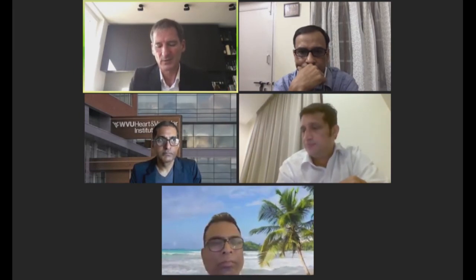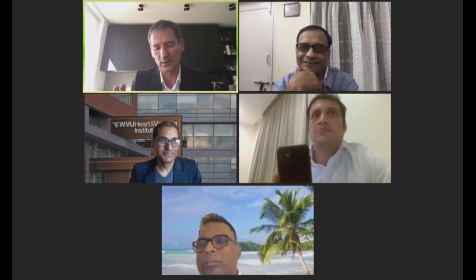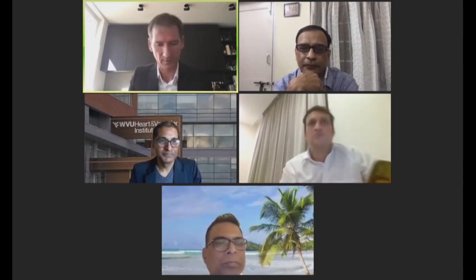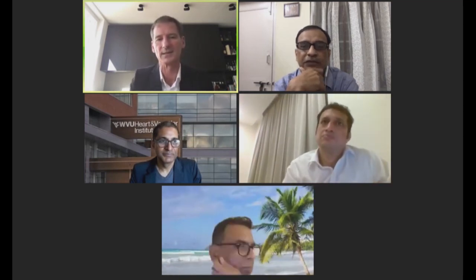Yeah, and so basically you take your measurements. I shouldn't say that, but I can say that because Professor Lam said that as well. So your umbrella size is not the most important. The most important thing is the disc is sealing and that you have the pressure, because that's your main closure.